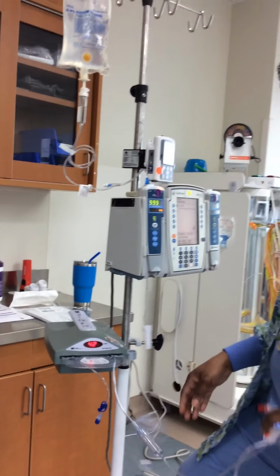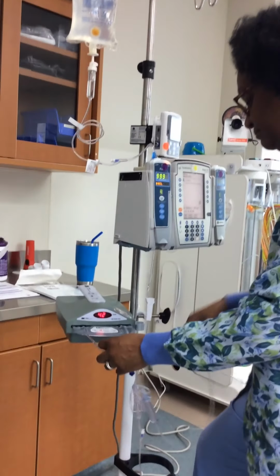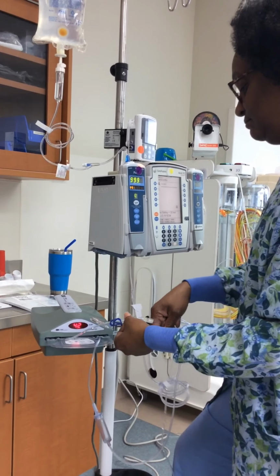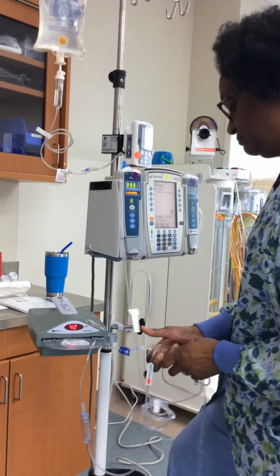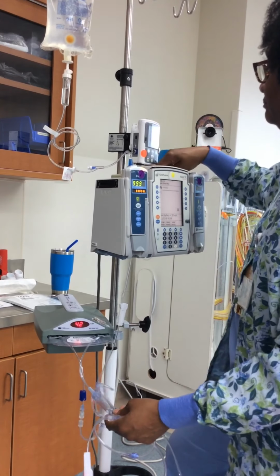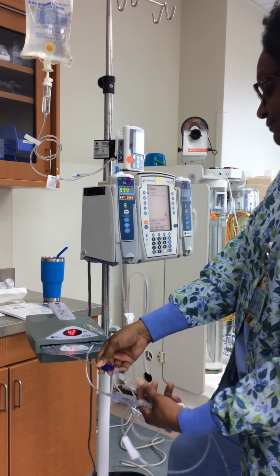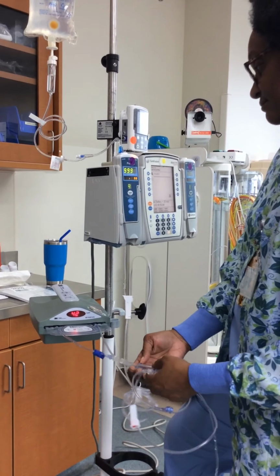Once you do have that slid into the machine, you can prime the cassette. When you prime the cassette, it kind of inflates like a float or a balloon. So that's what makes it impossible to insert it or pull it out when it is not empty. You insert the cassette all the way until you meet resistance. You will notice there is a blue cap for cool fluids, which connects to your fluid going in. Before you connect, make sure that your clamp is closed. And once connected, open the clamp and the fluid will start priming through the cassette.